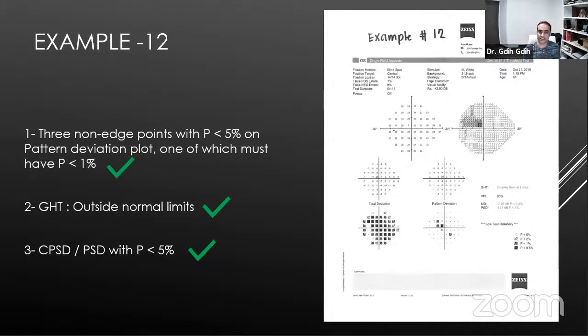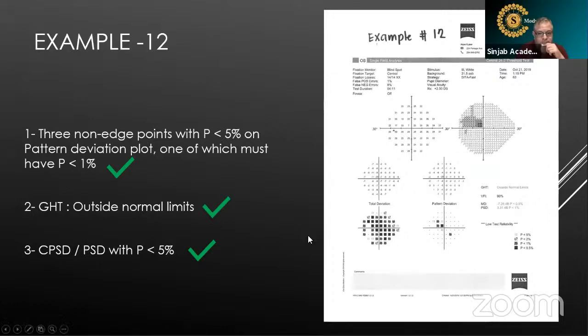It will see if this patient is still attentive. If at that particular moment they were looking away and they didn't see it, it will mark it as fixation loss. But they could have looked away at that particular time and then went back and did a good test in between. So we cannot throw out everything, especially if it is clinically correlated. Is that clear? Yes. Okay.